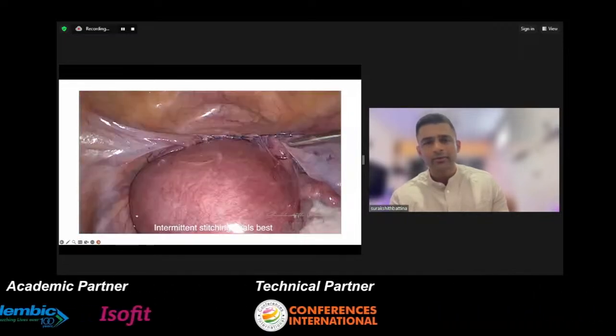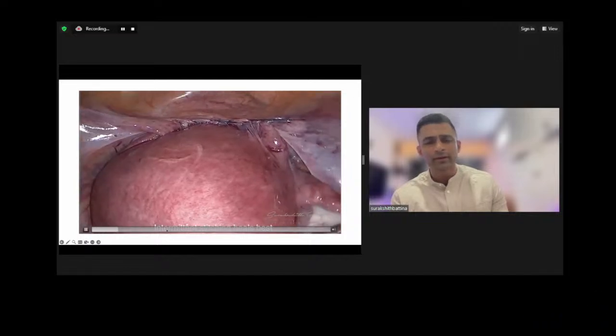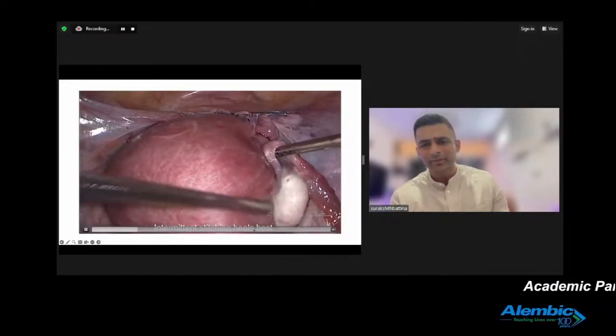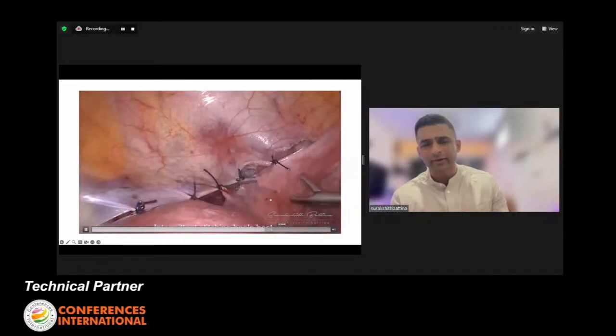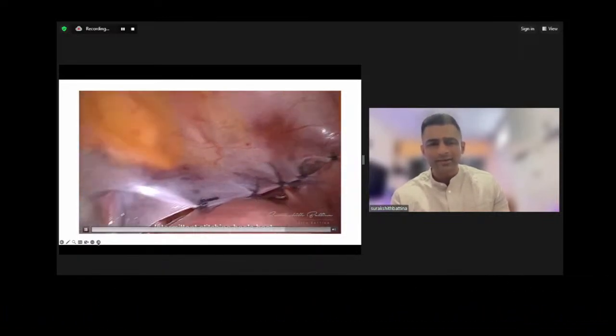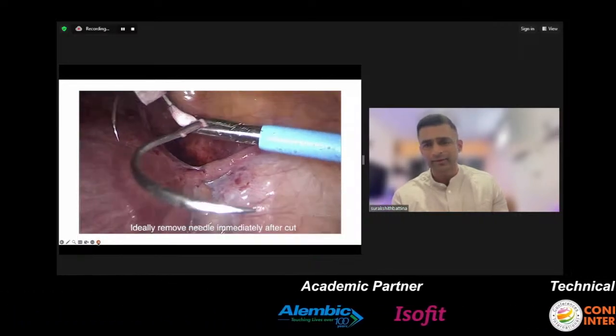Again, when it comes to how we can close the UV fold, we can use intermittent suturing. We have also used a single stitch for some of the patients. We have also done intermittent complete closure, but I found that just placing a single stitch is more than sufficient. It's pretty much the same as during the C-section process.